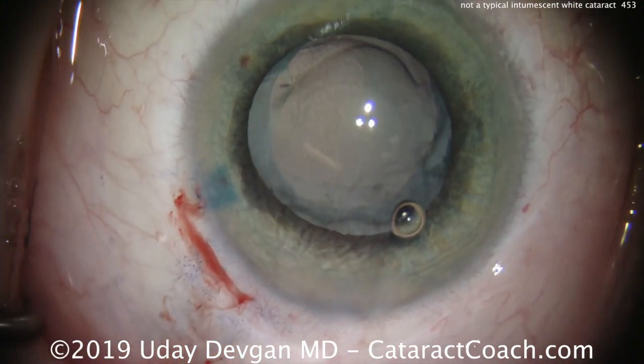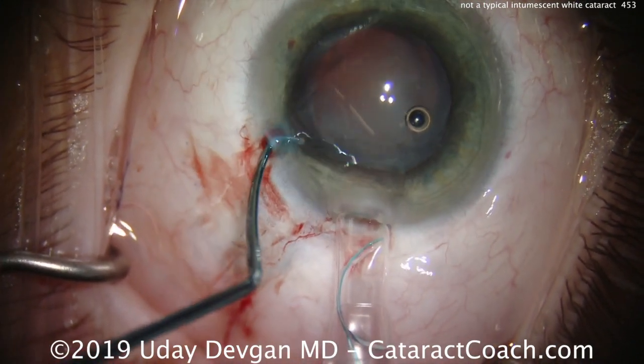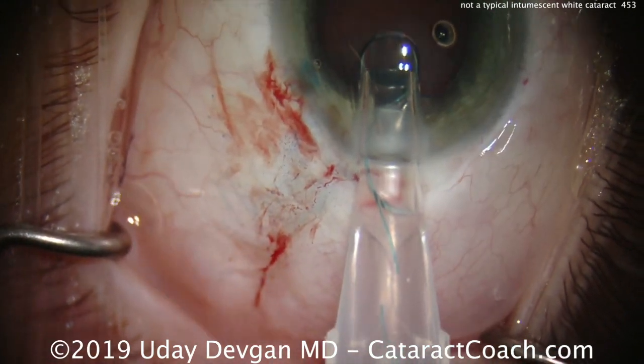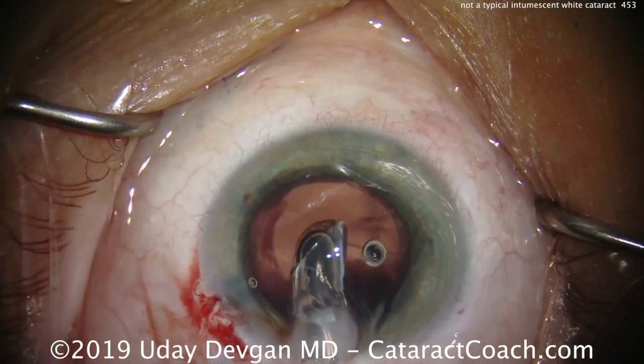This patient is a little myopic and she wished to retain her myopia, which I can understand now that I'm presbyopic. So here comes the lens. Again, it's an acrylic lens. Now the eye is obviously very soft, unicameral eye, prior vitrectomy, and we'll deliver the lens here.